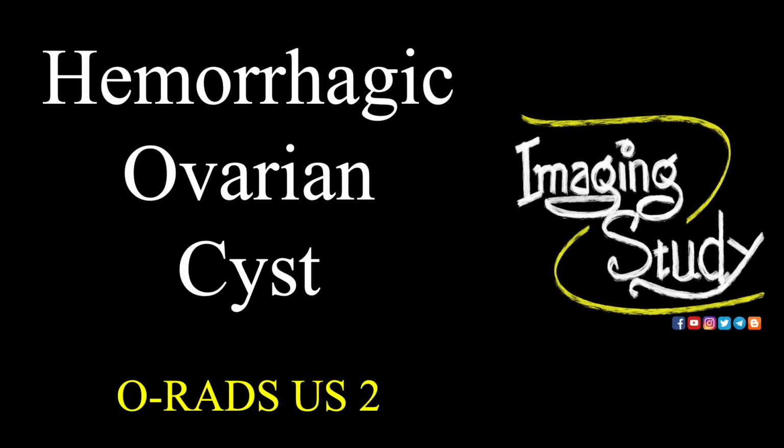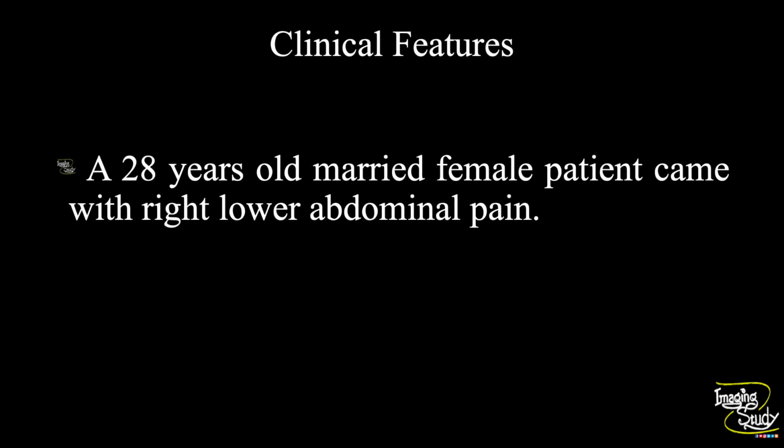Today we are going to see a case of hemorrhagic ovarian cyst. A 28 years old married female patient was sent to us with a history of right lower abdominal pain. Let's see what we have got on ultrasound.